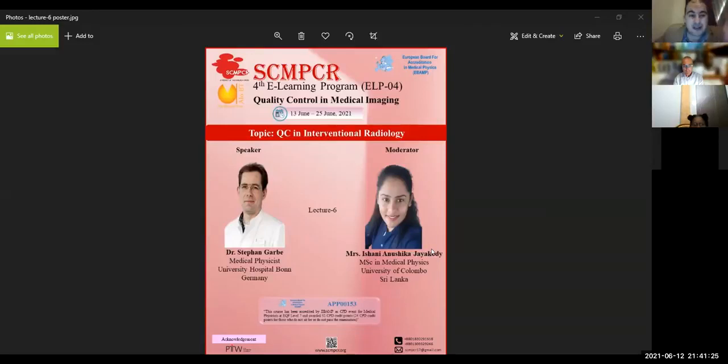Okay, for a moderate size patient, and a small patient, from 80 to 100 maximum. From 80 to 100 maximum. In a lot of papers, you can easily see them talking about low kV efficiency in case of contrast media, not only angiography. For a moderate size patient, use 120 kV only in case the patient is obese. It's clear? Yes, clear.